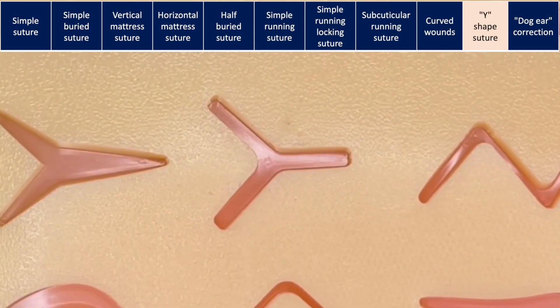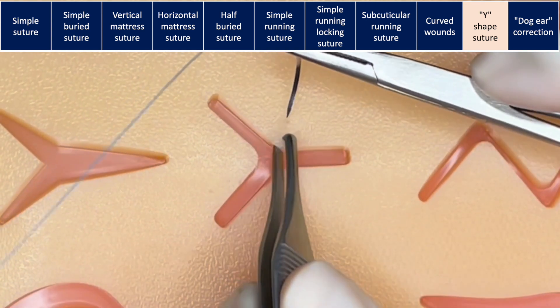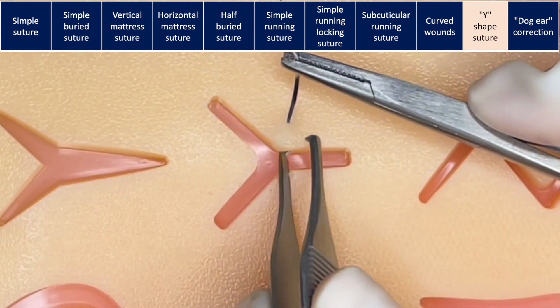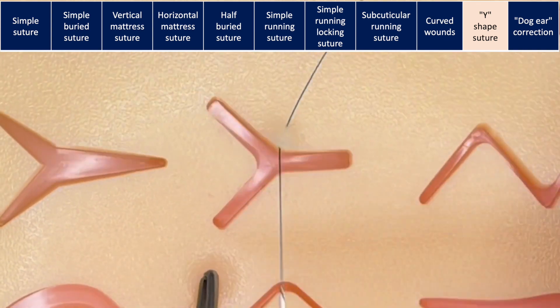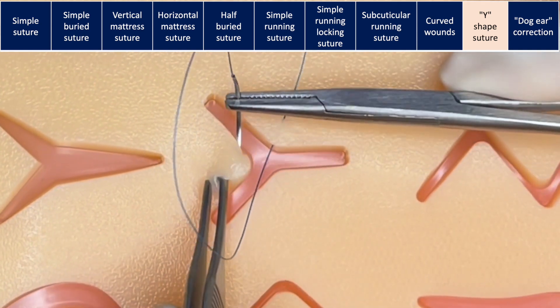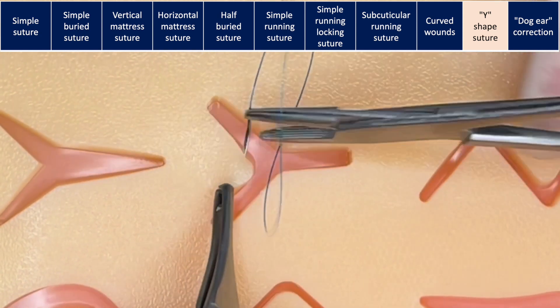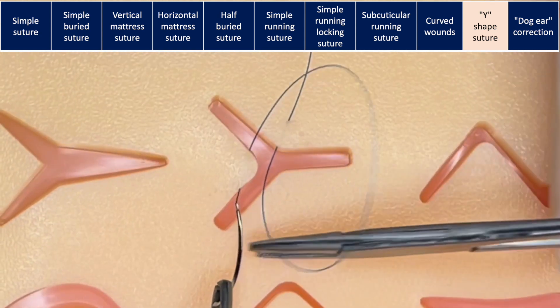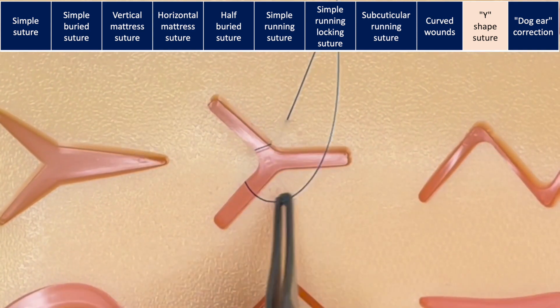A Y-shape laceration is a little more complex. The key is that first we're going to bring together the apex — that is the tricky area. You're going to start by entering the skin on one side, travel under the skin until the corner, and then pass the needle under the tip of the flap at the same level of the stitch — that is, in the subcuticular dermal area — getting a big enough bite, coming in on one side and coming out on the other.